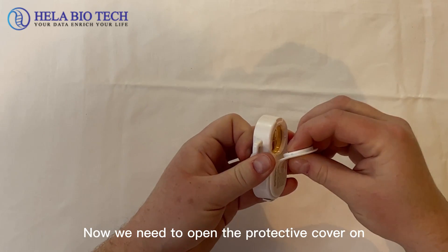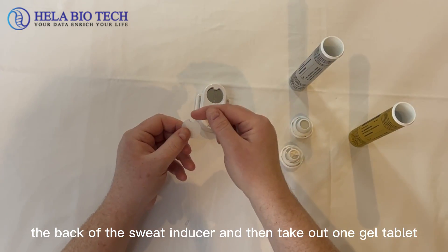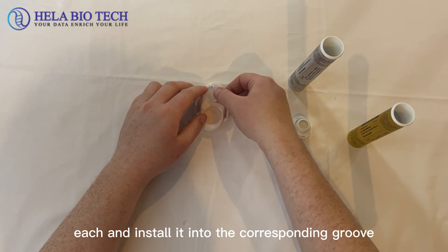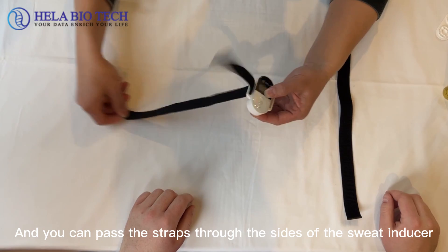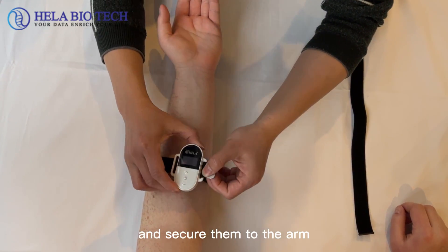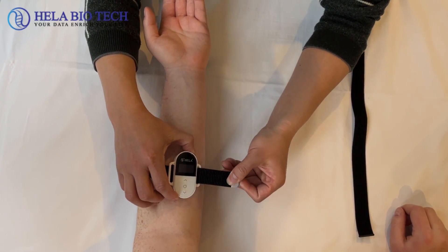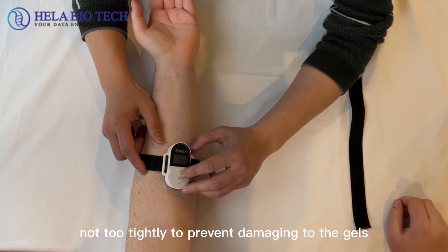Now, we need to open the protective cover on the back of the sweat inducer and take out one gel tablet each and install it into the corresponding groove. Then, pass the straps through the sides of the sweat inducer and secure them to the arm, not too tightly to prevent damage to the gels.